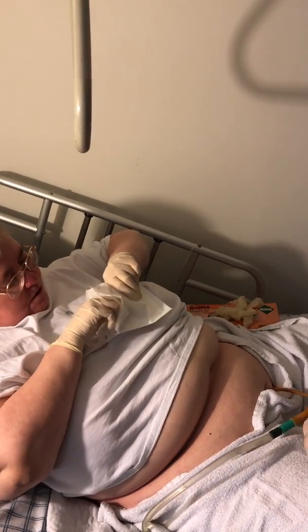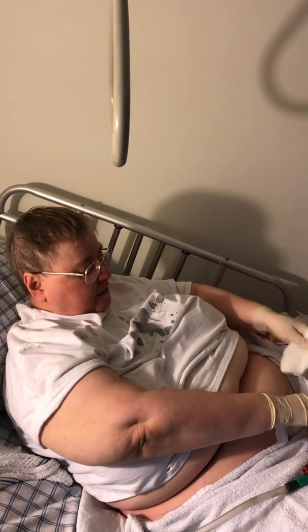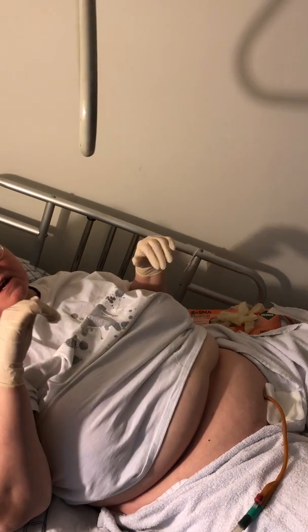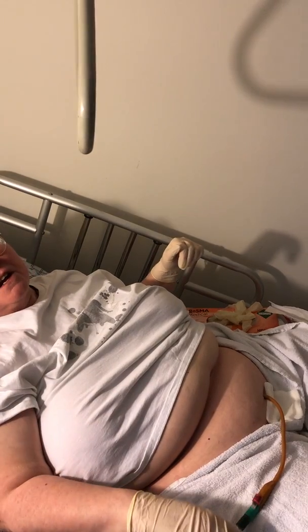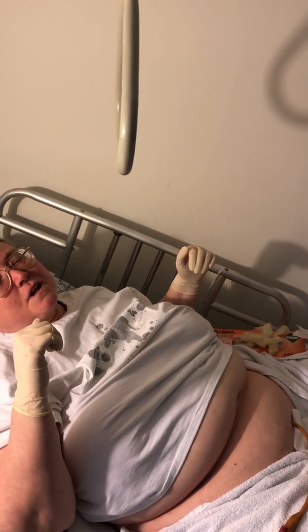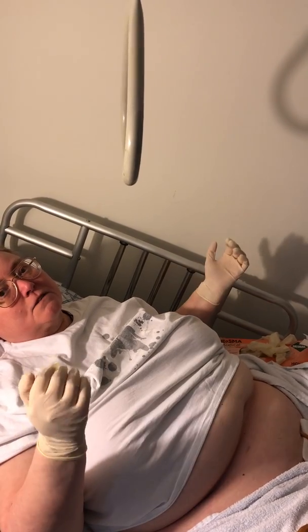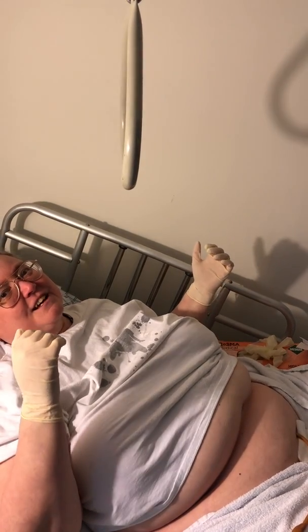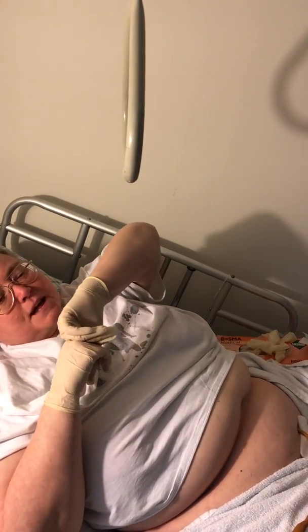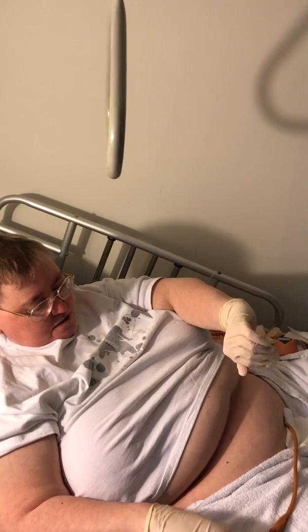One of the things we do is we use absorbent material right under the catheter as it comes out, because I tend to be very well hydrated during a catheter change, and it's hydrated enough to get instant return. And if you're really well hydrated and you take too long getting the new one in, you could have a volcano effect. And if you've ever experienced that, you know what I mean. It means the bladder gets more urine in it, it's going to come up through the hole if we don't get the new one in fast enough.